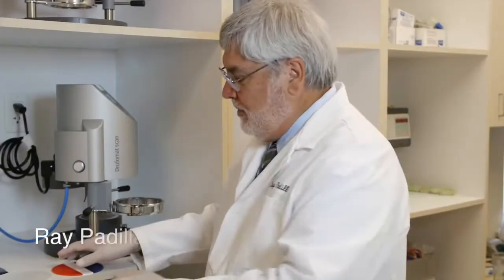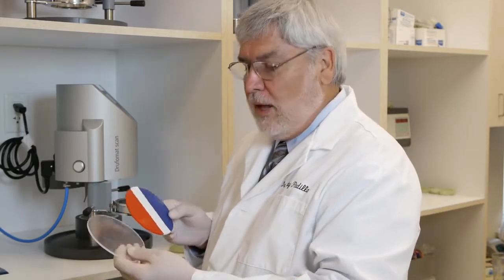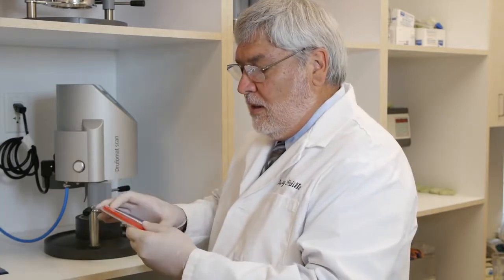I'm Dr. Ray Padilla. What we're going to be making today with the TechFit fabrication method is a dual laminated mouthguard. We're going to be using 2 layers of 3mm material. First layer colored, second layer clear. Each layer is 3mm thick. This will not give you a 6mm mouthguard.